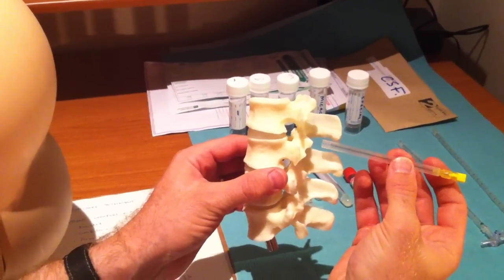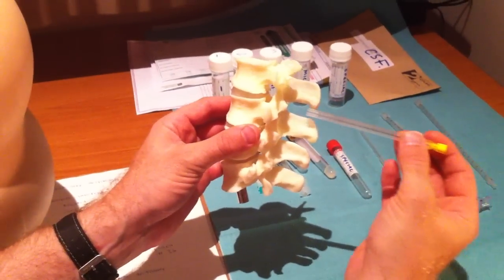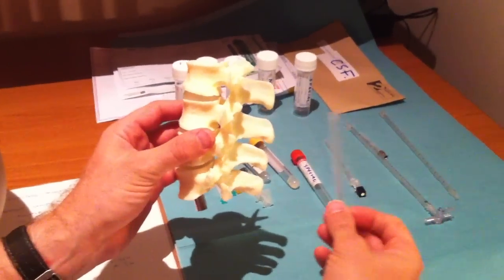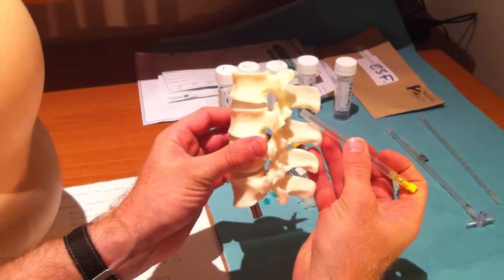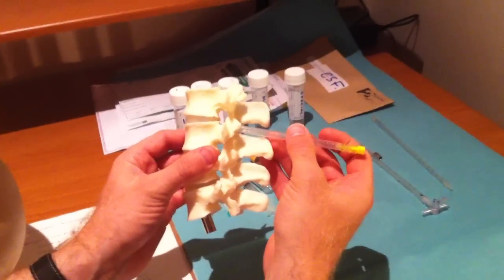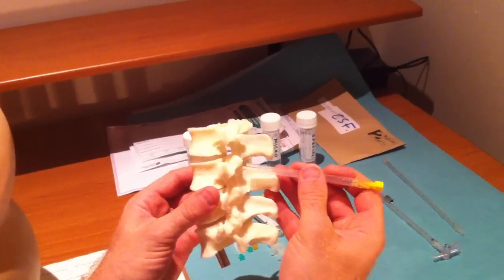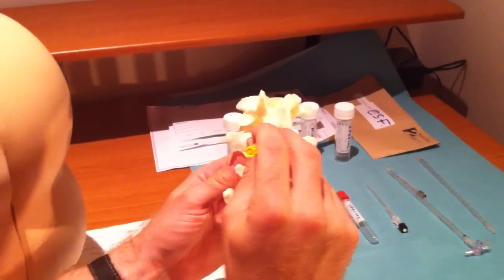If the needle is completely up to the hilt, you've either gone completely offline or you have a very obese subject and are running short of space. If the needle hits bone, the usual problem is that you're lodging it on the inferior aspect of a spinous process. The correction is to bring the needle more in line with the trajectory to get you through that diamond-shaped hole. If you're slightly offline, you may hit one of those facet joints and again need to redirect the needle.